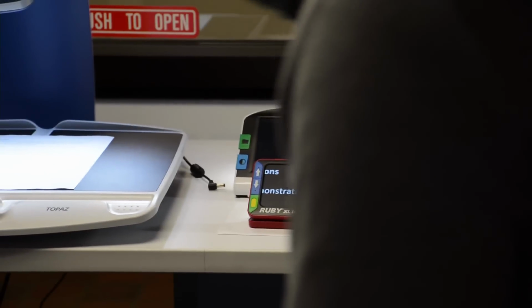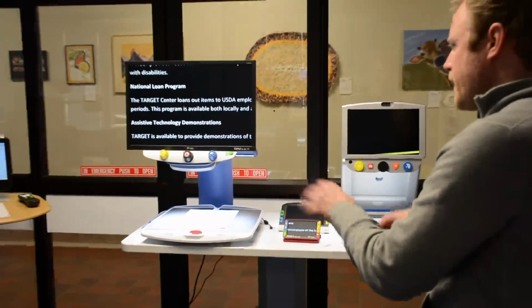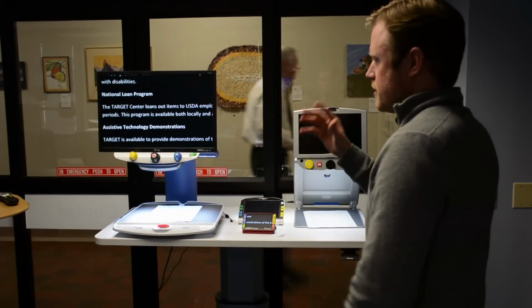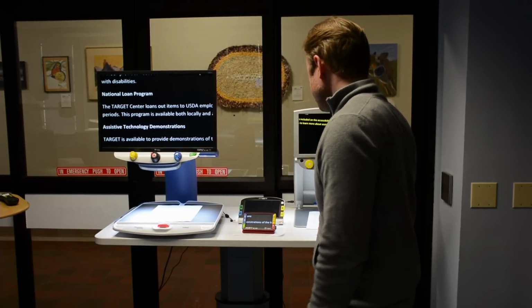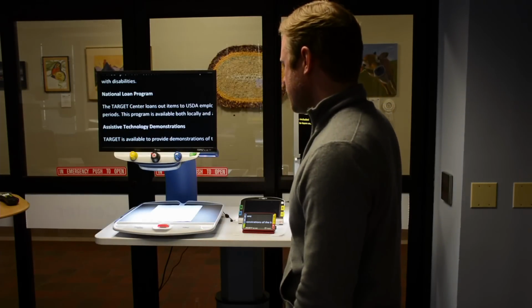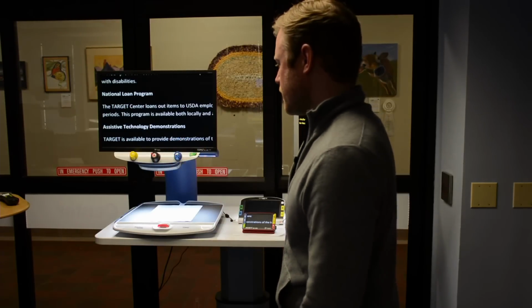So those are a lot of just the different CCTVs out there. There's lots of different manufacturers of these. They all vary in specs. They all, at a basic level, do the same things in terms of magnification and contrast adjustment. But they may have little things you may like and other things you could hate, which could drive you towards different models.